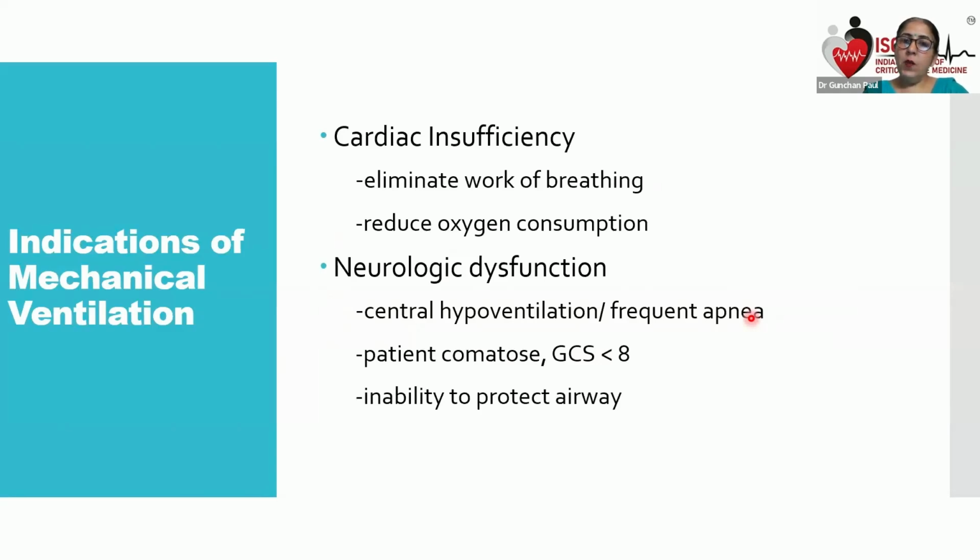We will eliminate the work of breathing done by the patient, and we will reduce the oxygen consumption, because patient is breathing tachypneic, he's breathing very fast, he's using all his energy in breathing. So if we sedate and put him on mechanical ventilation, his oxygen requirement will decrease, the cardiac will also get offload. So in patients of cardiac insufficiency, also mechanical ventilation is given.